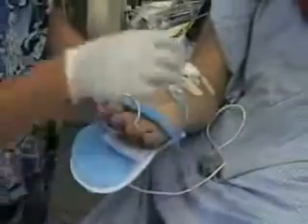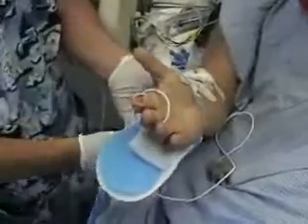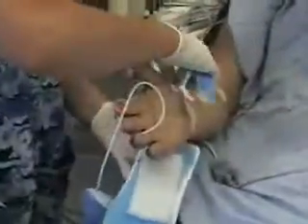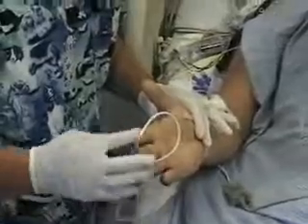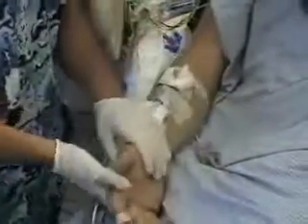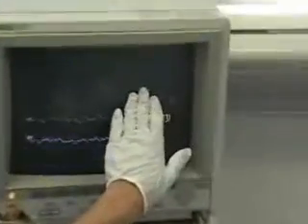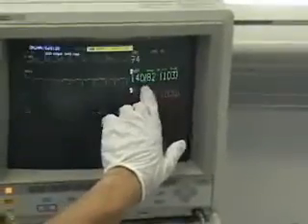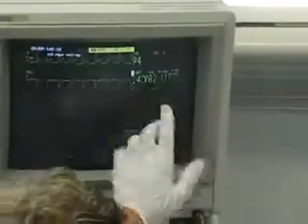We're going to remove this here. You always assess with your patient if there's numbness or tingling in the fingers and look for edema — it's a complication of having an art line. You have your art line waveform up here and usually it's really consistent with your cuff pressure, which is above here.